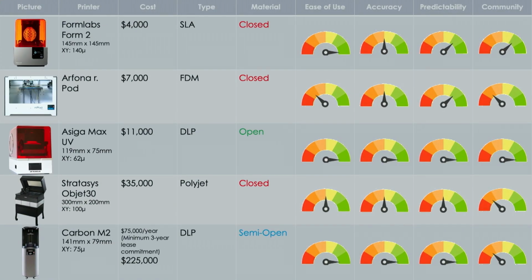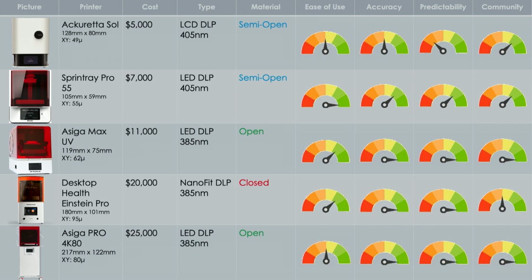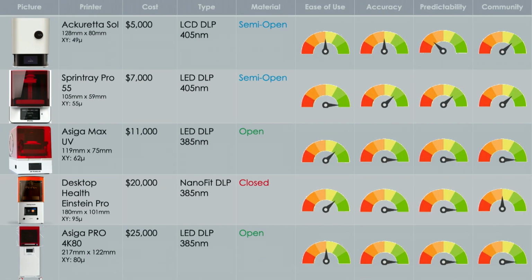Compared to a few years ago, you'll see the technologies have changed quite a bit. Everything's converged towards DLP, which is the de facto standard. Again, I'm not going to get too much into detail regarding the actual technology, but the simplicity of it is that something like a Formlabs with the SLA is a single laser that's drawing something out, right? Which is a little bit slower, like drawing something with a pencil. Whereas DLP is like if you had a stamp and you're stamping each individual layer. The downside of that, of course, is when you're printing with a DLP printer, to keep the resolution very high and also keep everything very accurate, they keep those build platforms a little bit smaller. So you're going to see all these build platforms depending on their size, right?